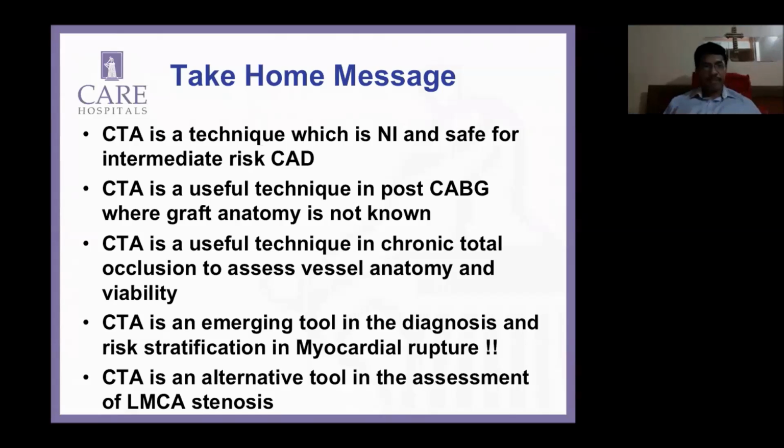I wouldn't recommend anybody to do CT for viability as an independent tool. These are very early days for CT, and we like to minimize radiation risk to our patients, so my first choice will always be an MR. But if somebody comes in with an unknown heart failure and you want only one investigation, I am getting experience doing CT because I get the coronaries, which is the holy grail for whether there is CAD or not.